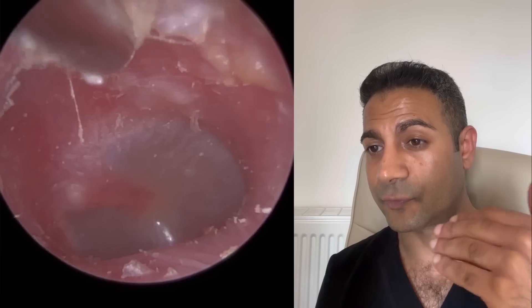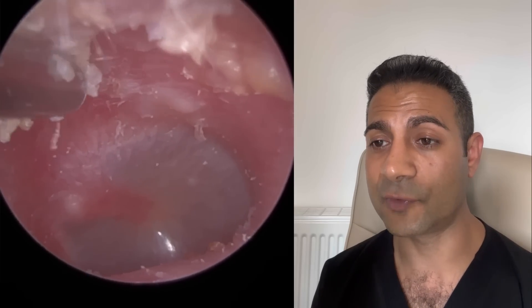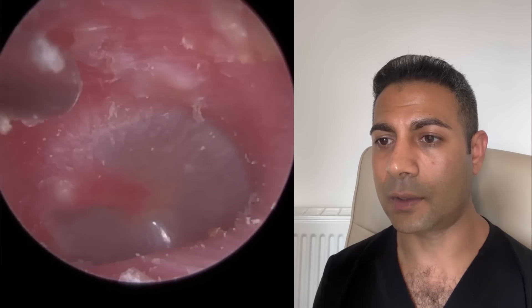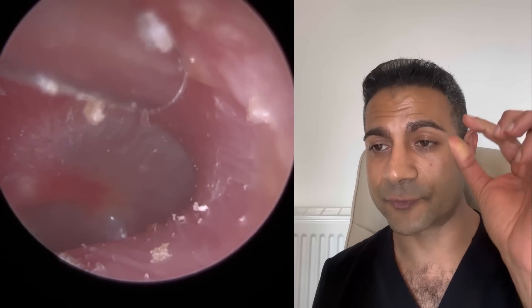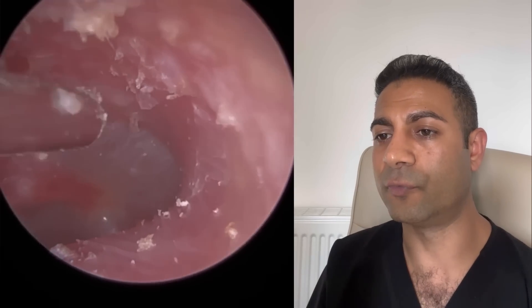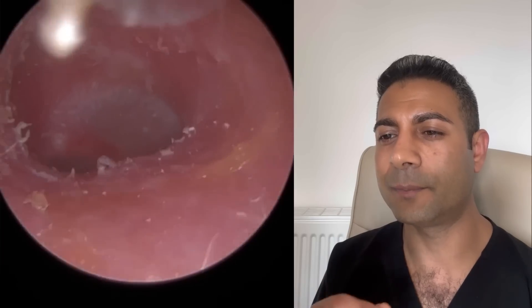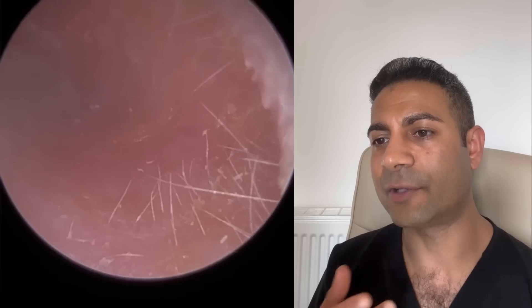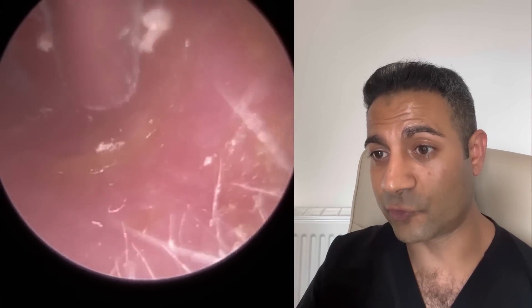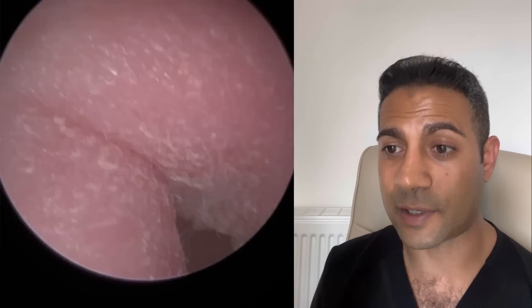I'm just using the fine end, peeling away some soft skin at the osteocartilagenous junction — the part of the ear where the bone and cartilage meet. You can tell because the skin lining the bony section of the ear canal is a thin layer, so you're able to see the blood vessels a lot more and that part looks a lot more glossy. Whereas the skin lining the outer third of the ear has three layers and a more matte complexion — it's generally less red because the blood vessels are in the deeper layers. As I'm going in and out, see if you can identify that boundary between cartilage and bone in this patient.